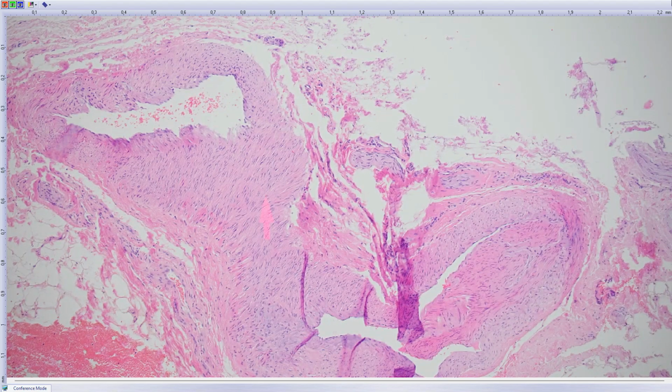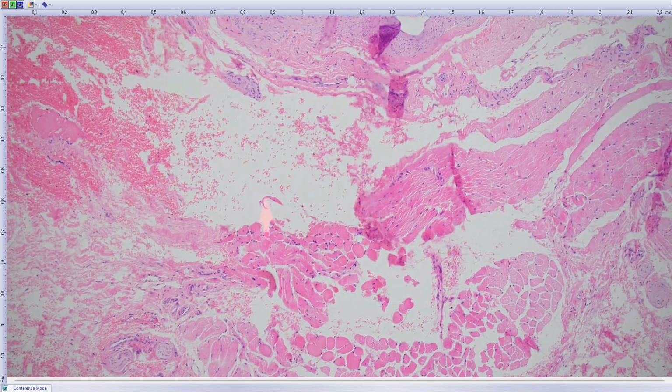No, it's different, sorry. I have only this one here. Then I have this case of skin. I've got to consult.